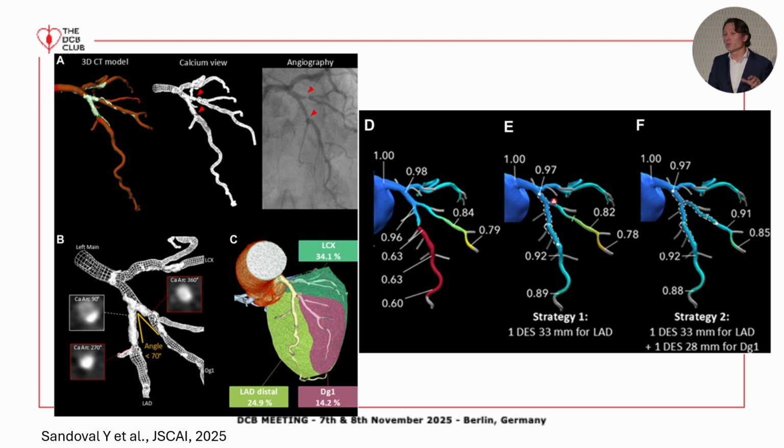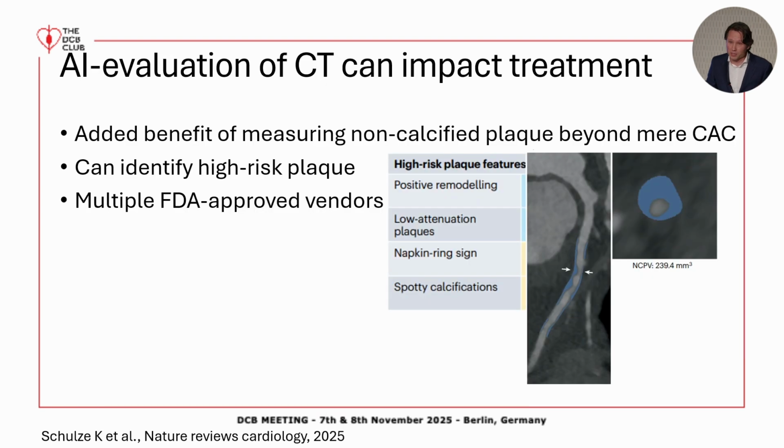Of course, the limitation is that we know this for drug-eluting stents, but this is not known for drug-coated balloons. And also with the late lumen enlargement effect seen in some DCBs, this may be completely different for type A DCB versus type B DCB, and it may be different 1 week after the procedure compared with 9 months after the procedure. So again, important knowledge gaps.